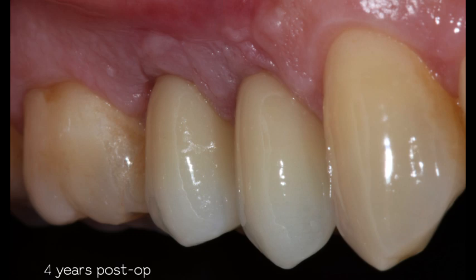So this approach allowed me to achieve in a very simple way that I've tried to make it comprehensive here. But this has allowed me to achieve this kind of natural results without going through the complexity of huge regenerations, huge stagings. We're talking about 4 to 5 months to get here. So in a very predictable way that I couldn't do, I would say 11 years before.